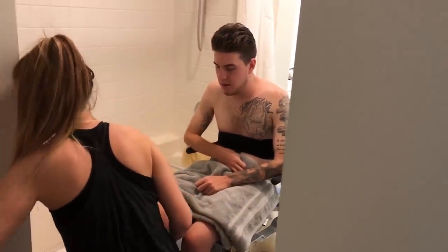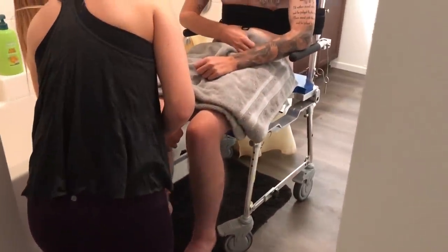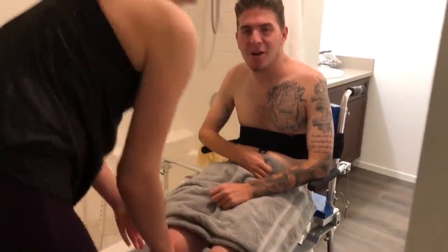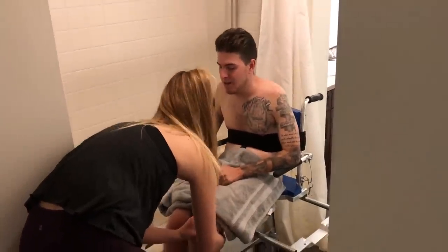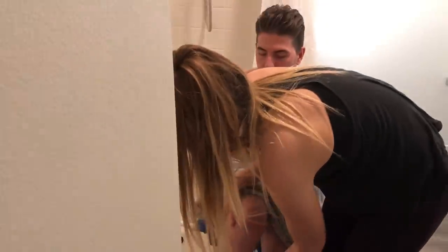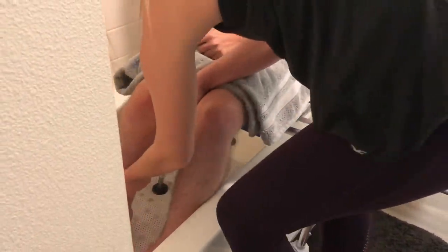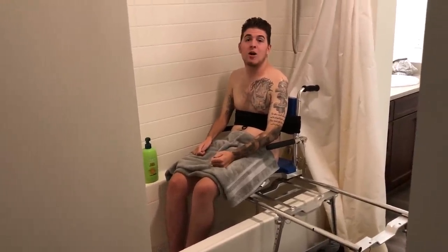It's a little hard because I have a super spastic body — my body spasms a lot — so it makes it a little difficult and scary doing this, but we haven't had a problem yet. So now she has pulled the lever and she's going to slowly slide me over into the tub, and once we hear that click that means I'm secured in the tub.